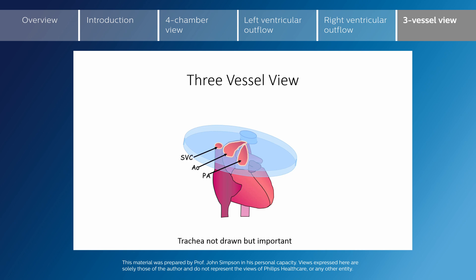The trachea is another important reference point, not shown in this diagram, which is seen posterior to the superior vena cava and should be to the right of the V indicated by these vessels. The trachea should not appear between these vessels — it should be outside of this V.